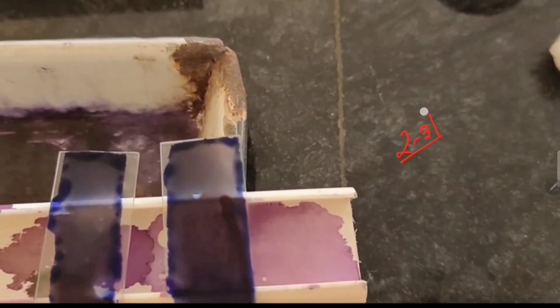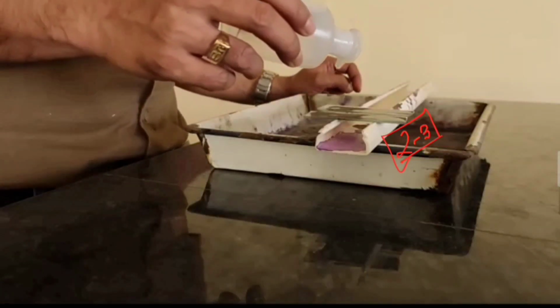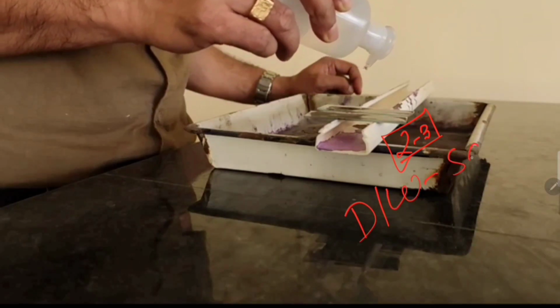We should not let it dry, so you should always look for that. While waiting 2 to 3 minutes, we should not let it dry. If the Leishman stain dries, then a dark colored patch will form, so keep it wet. Now I am going to add distilled water. So distilled water, the same number of drops.